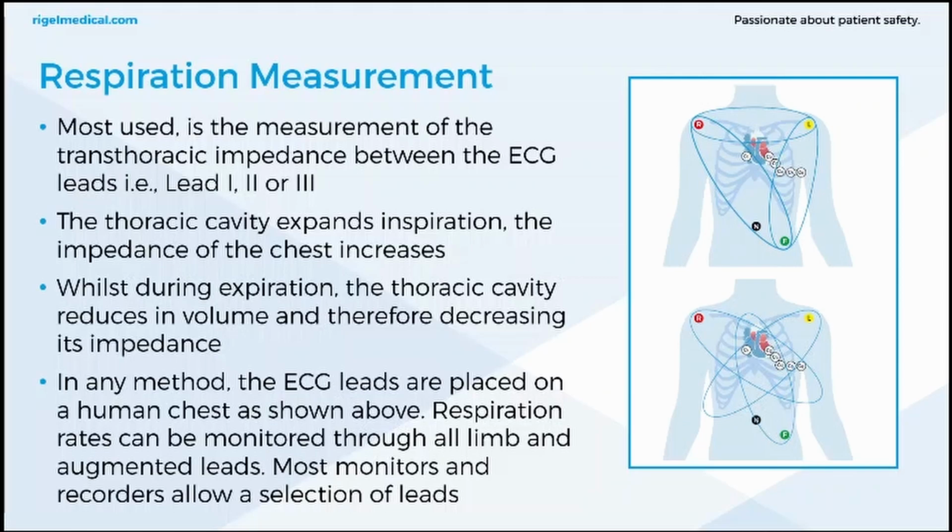Now there are other ways of measuring respiration using the ECG leads, and that's by looking at the change in ECG amplitudes, and that's as a result of the change in the position of the electrodes, as the heart moves. So it looks at actually the amplitude of the ECG rather than resistance, but I won't talk too much about that one.